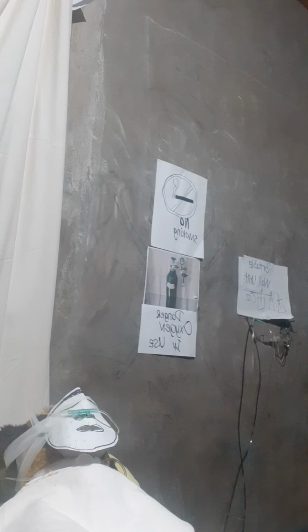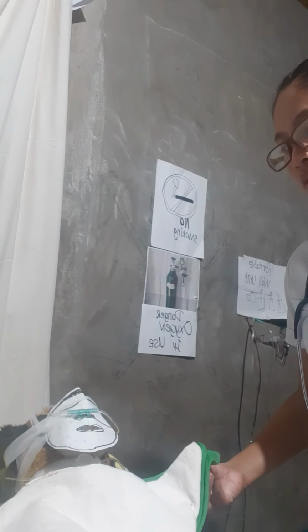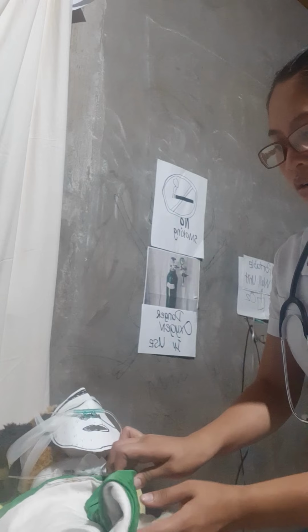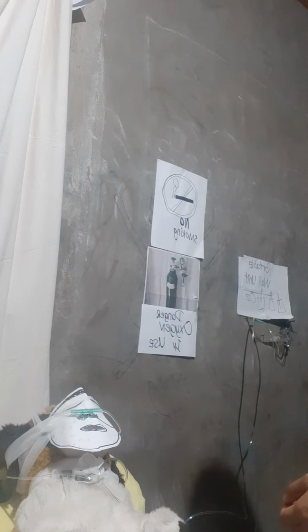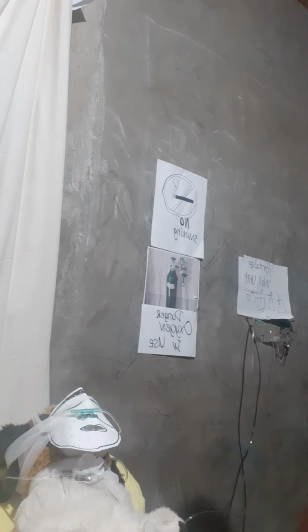Then afterwards, we need to remove the face shield and goggles or mask, and make sure to put them into the proper receptacle.